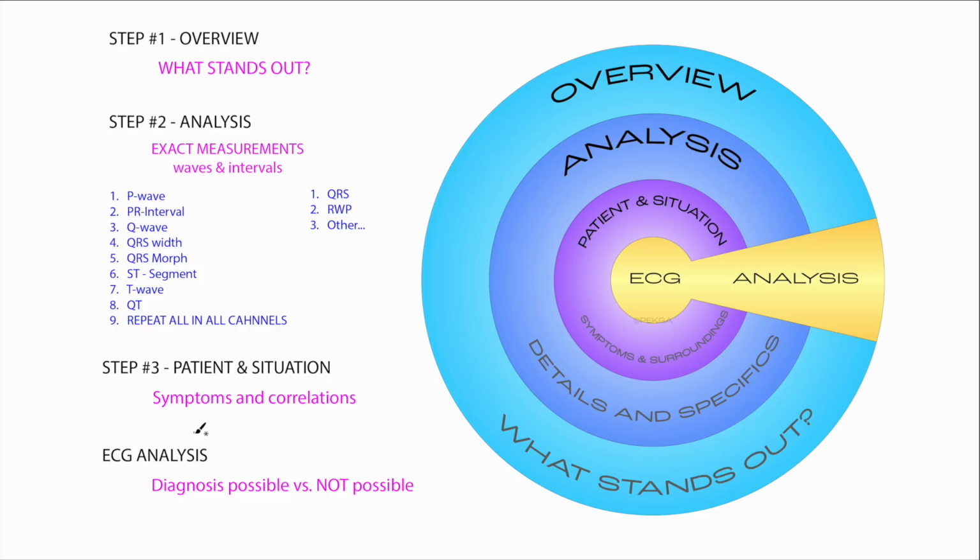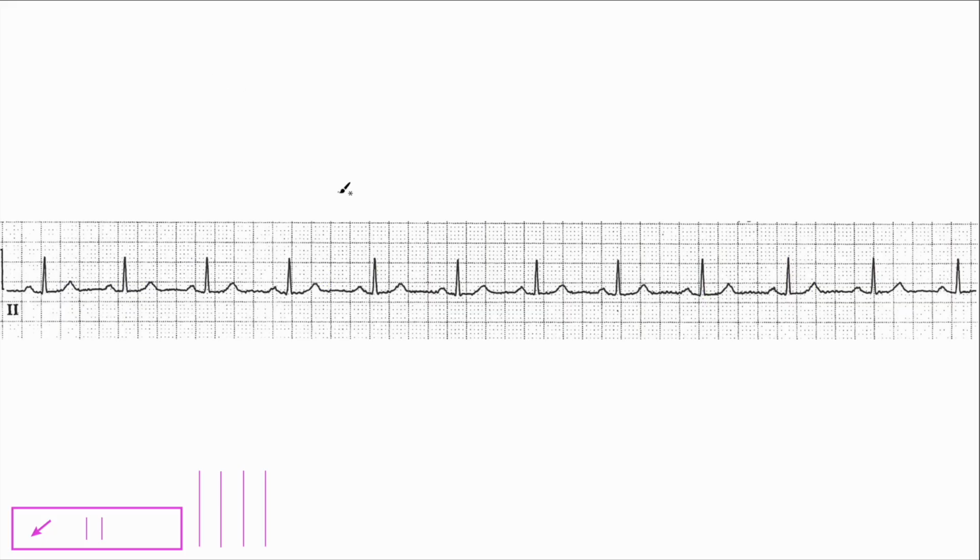And finally, if you have these 3 steps, the overview, the analysis, and you understand what was going on with the patient and the situation at the time, you should be able to do a full ECG analysis, which leads to a diagnosis. So ECG analysis is a part of a diagnosis. Going through the first 2 steps will not yield a diagnosis. Well, maybe you're that good, but typically it's not enough. Okay, so let's get into it.